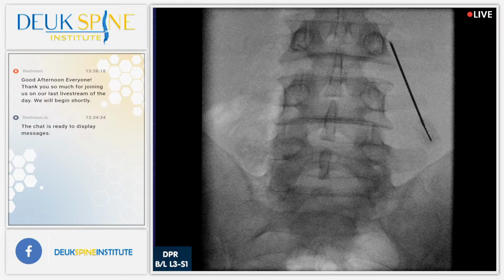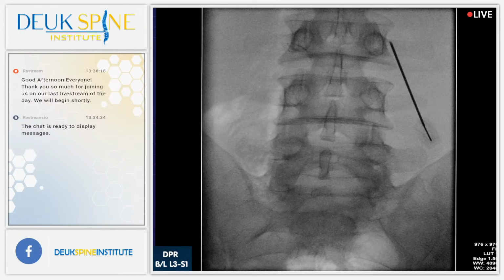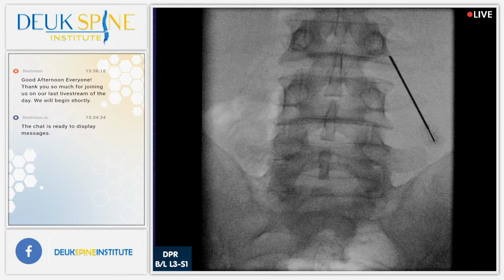Seems awfully close, right? That should be it.